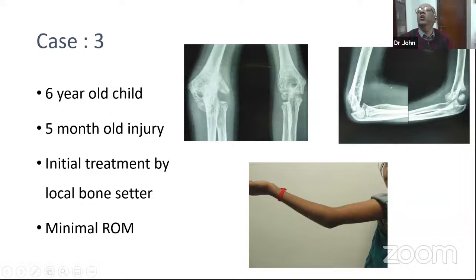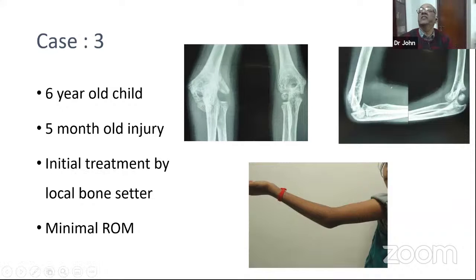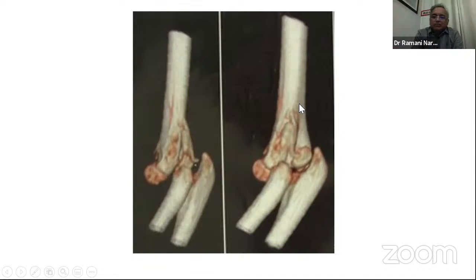This fragment is the lateral condyle, which is not really visible on the AP. Is it the lateral condyle? Lateral condyle is seen well. The medial condyle, so lateral condyle is here with the fragment. So what is this? Oh, that seems to be a problem. Yes, I'll show you a CT. I'm just showing you the 3D, because the medial epicondyle has gone inside the joint along with it, dislocated elbow. No, so what's happened is basically the lateral condyle along with the shaft is dislocated, while the medial condyle has kind of stayed behind. It's subluxed, and the interesting thing is it's united with the shaft. Very interesting. Type 5 kind of medial condyle. Okay, so now what would you do?